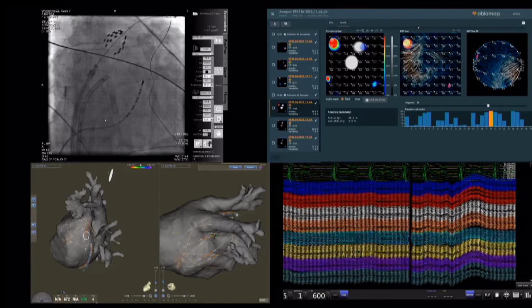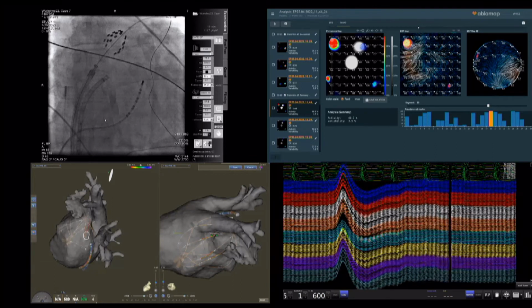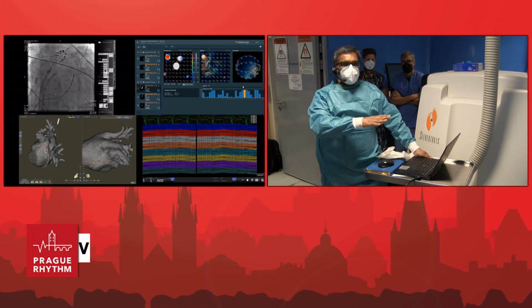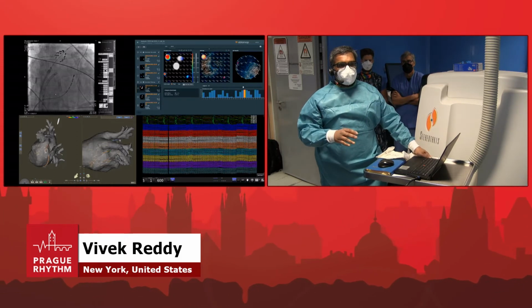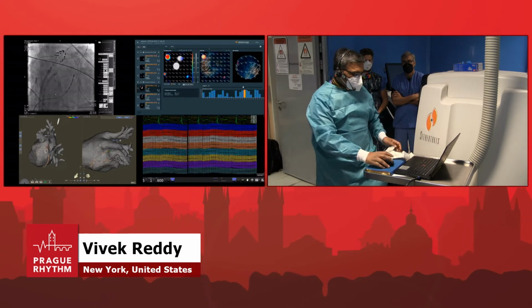Then Toshi is going to do PVI with Farapulse. Since you've already seen 2 or 3 cases with Farapulse, we're just going to do that in the background. While he isolates, I'm going to explain the mapping system and the mapping technology. And by the time I'm done explaining, Toshi will probably be done with this PVI, and then we'll look to see what's actually residual, okay?